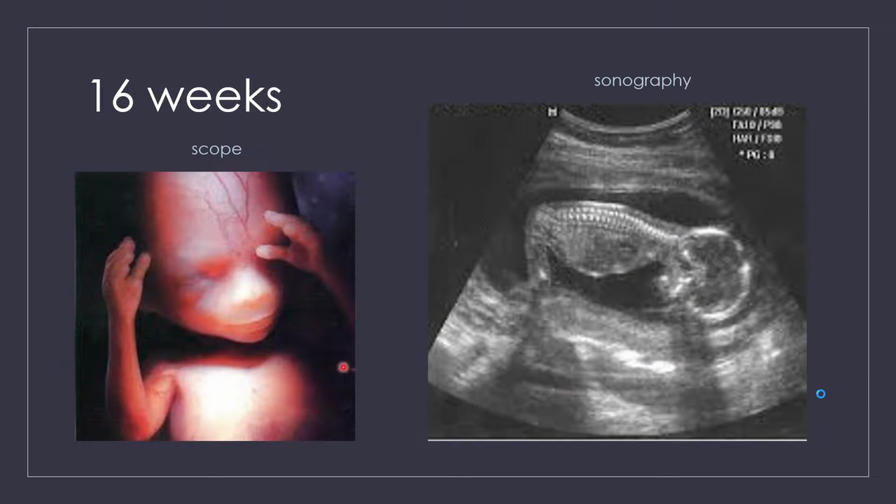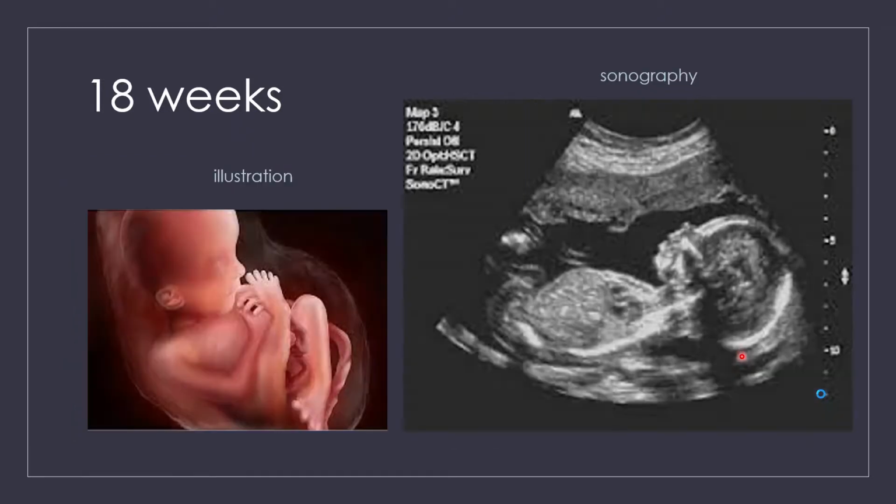At 16 weeks, the scope. And with ultrasound, we can see the vertebral column really well. See all the vertebrae. 18 weeks. This is an illustration. It's just to show that it's just starting to gain in length.